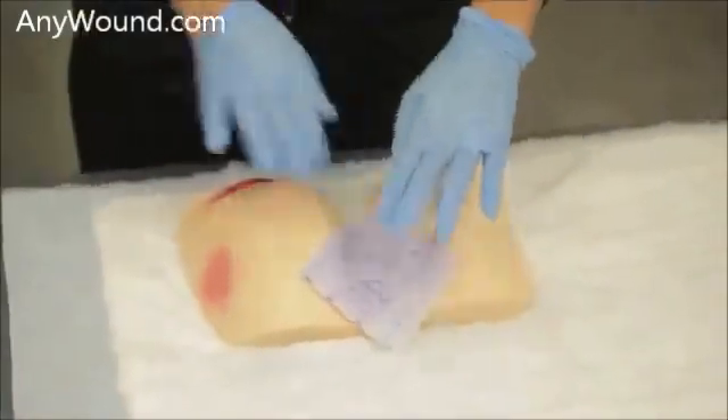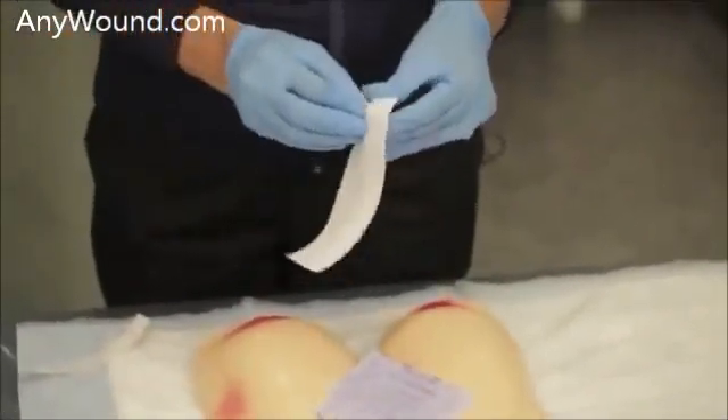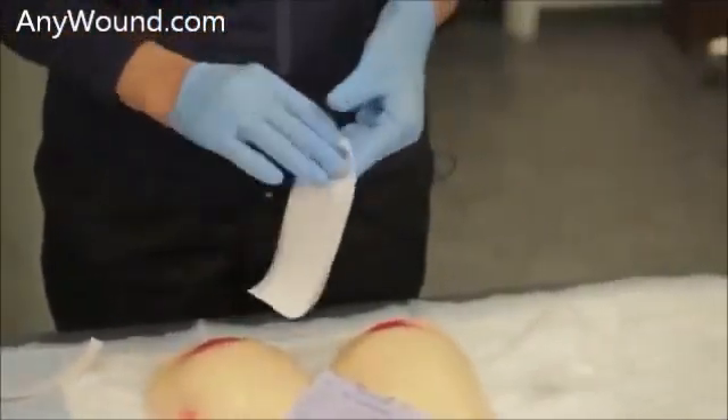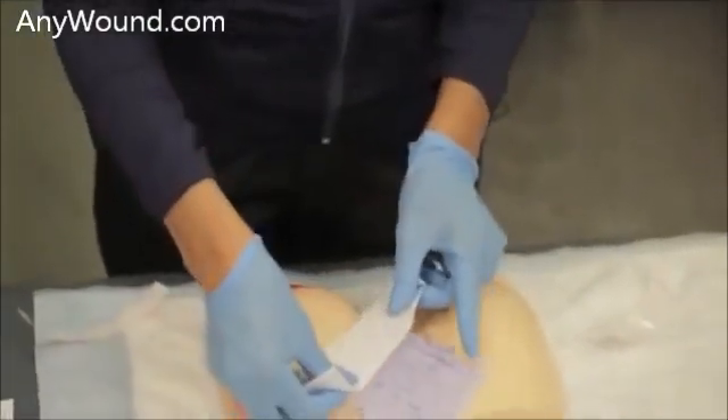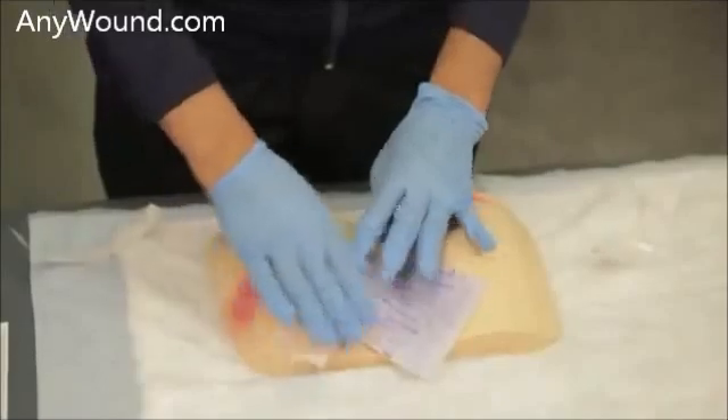Once the dressing is placed, you will secure it with tape along the borders — these are the borders of the edges of the dressing. Try to be sure that you include any of the peri-wound erythema if necessary.